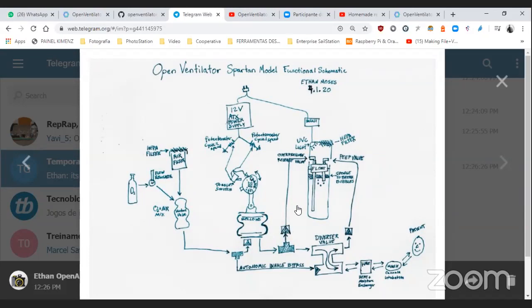On level four, we would need very fancy pressure sensors to have very good precision on the millimeters of water and the curve that this pressure is taking inside the patient's lungs. In my way of seeing it, I saw a lot of engineering approaches, but all of them have to consider that we have medical concerns that are really, really important. We have to pump, for example, a lot of air in a short period of time, like 1 second, and the breath out must sometimes be in 6 seconds.